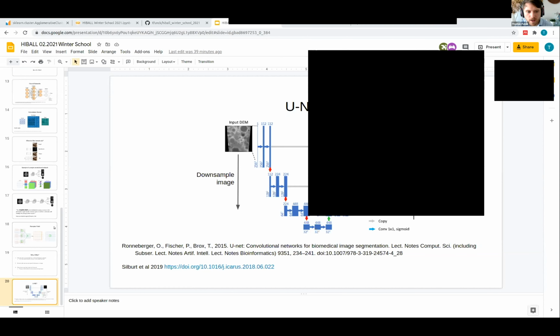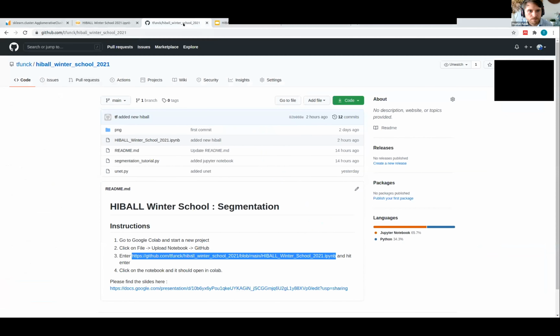In my experience, it seems very dependent on which seed points you pick. And if you can clearly identify what the seed points are, then you have a better chance of it working well. If you go through the worked example, you'll see that if you change the seed points a little bit, you get very different results. So for our worked example, it's not very stable.